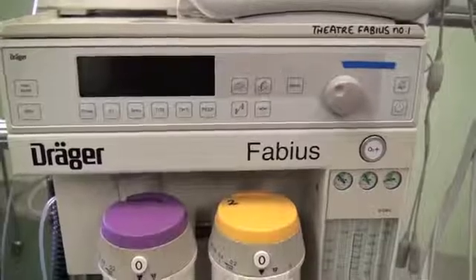Today we are going to run through the machine check of the Draeger Fabius. The aim of this video is to demonstrate the fundamental principles of checking any anaesthetic machine.